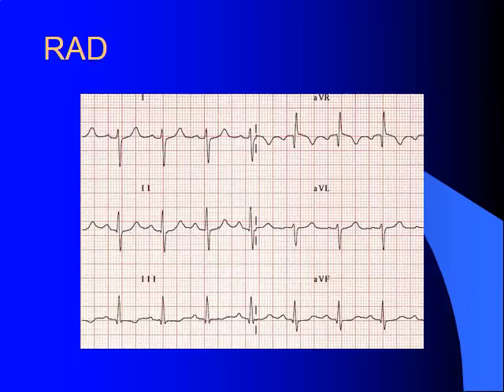But using the method that I want to teach here, we're going to look for our most equiphasic lead, which is, again, lead 2. And then perpendicular to lead 2 is lead AVL. AVL is mostly negatively deflected down, so we look at our down arrow, our axis is 150 degrees, which is a right axis deviation.